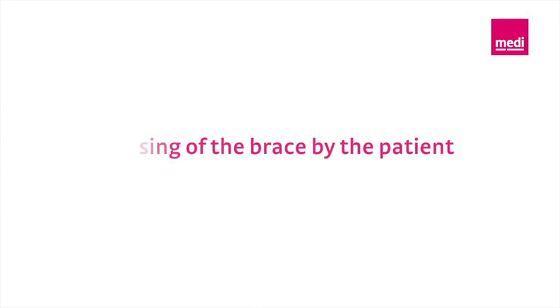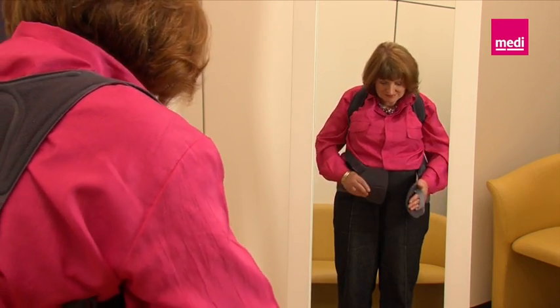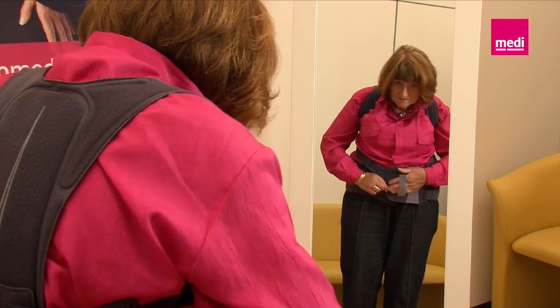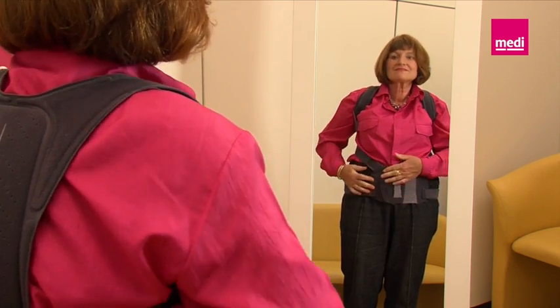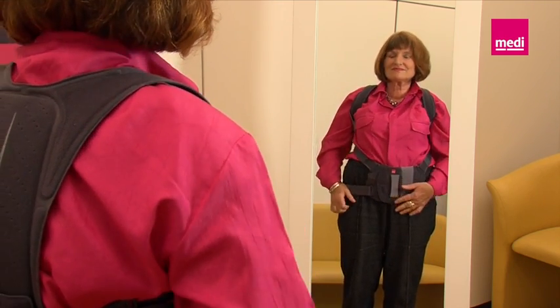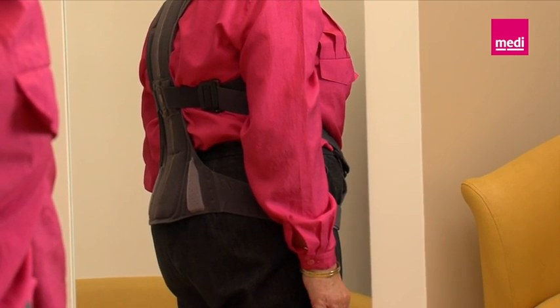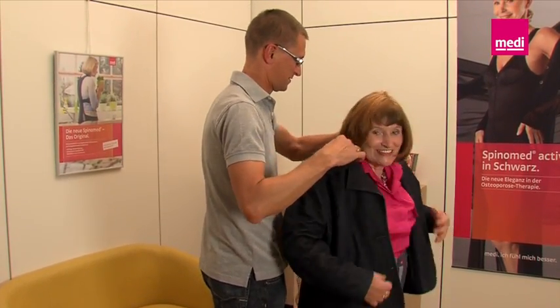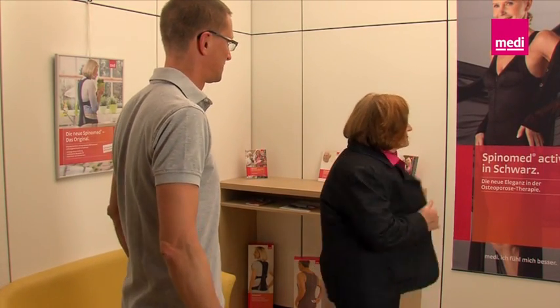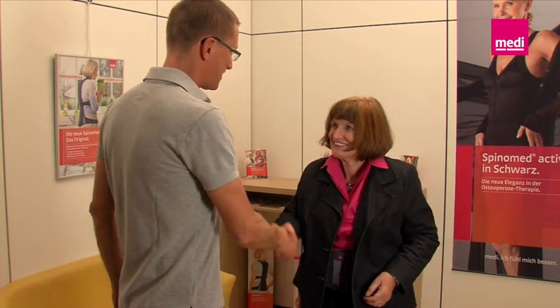Closing of the brace by the patient. The patient can now put on the brace like a vest themselves and close it using the hand straps on the stomach pad. Ideally, this should be done in front of a mirror so that the patient closes the stomach pad at the level of the pubic bone. The SpinoMed brace is now optimally adjusted to the patient and can be worn under a jacket without being seen. A new patient has been treated with the SpinoMed brace, improving their quality of life.